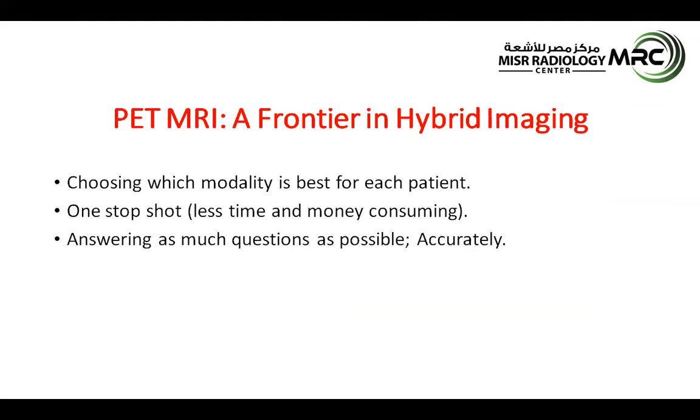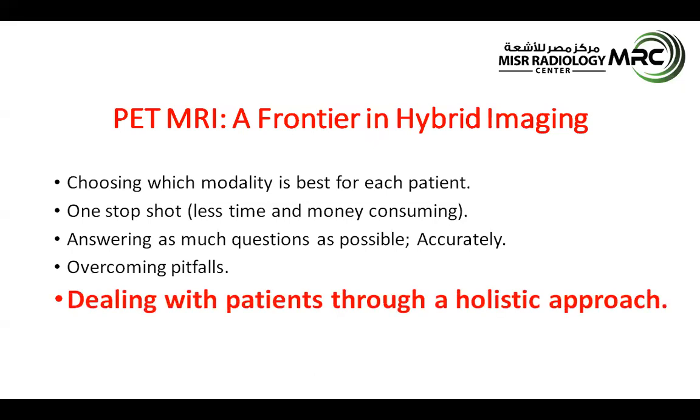Dealing with each case as a unique setting to be tailored. So we tailor each study as much as possible to give you as many answers, accurately, as possible, and then overcoming the pitfalls. And what is important, as I have discussed in the above cases, is dealing with the patients through a holistic approach and not only being pathologically minded with what the patient is definitely coming with. Thank you very much.